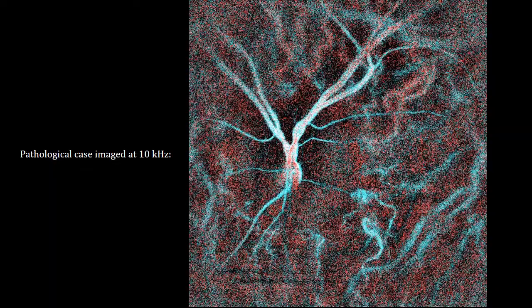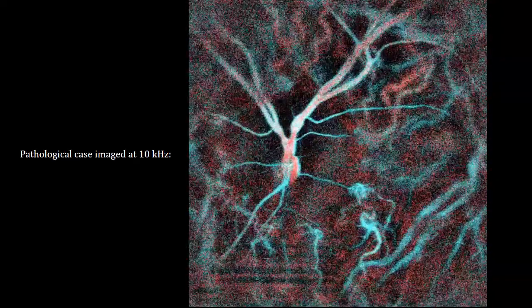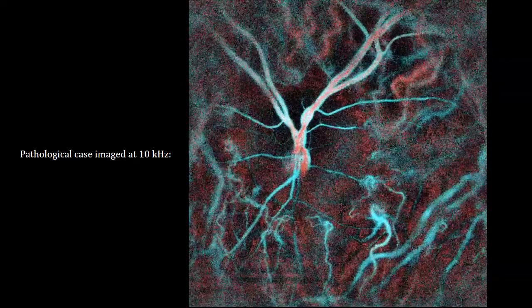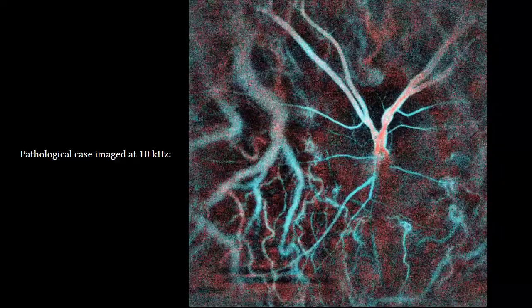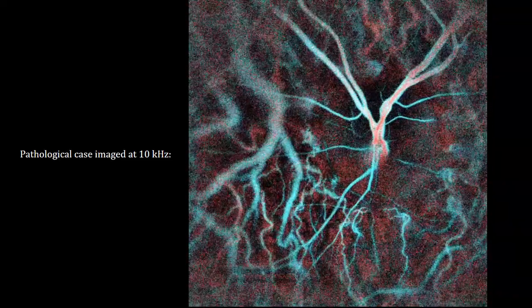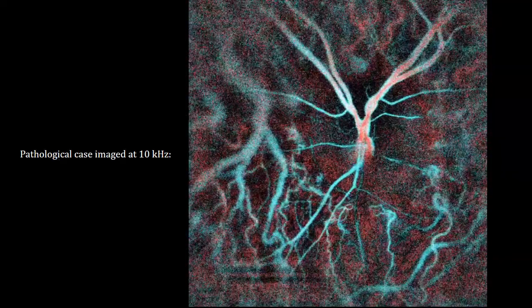So here is an example of a pathological case of blood flow image in reverse contrast at 10 kHz, and you can see that we are able to nicely reveal this pathologically decreased blood flow in the retina and choroid very nicely.